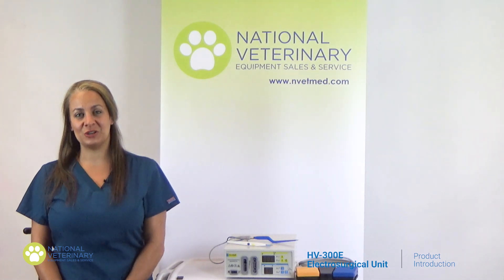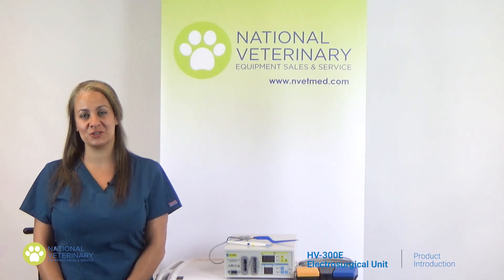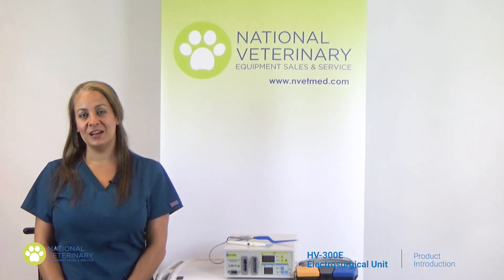This electrosurgical unit offers coagulation and cutting capabilities as well as monopolar and bipolar features. The intuitive design and user-friendly setup of the electrosurgical generator is designed for today's modern operating room. It features both monopolar and bipolar functions to satisfy a variety of surgical demands.